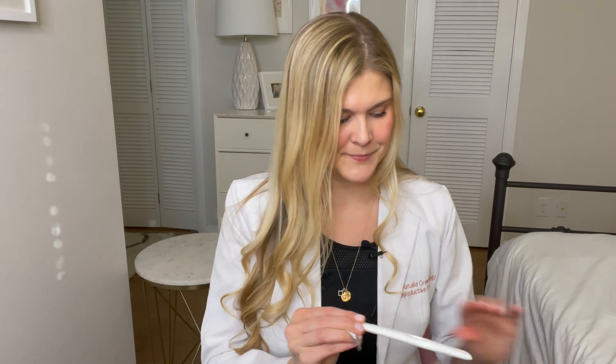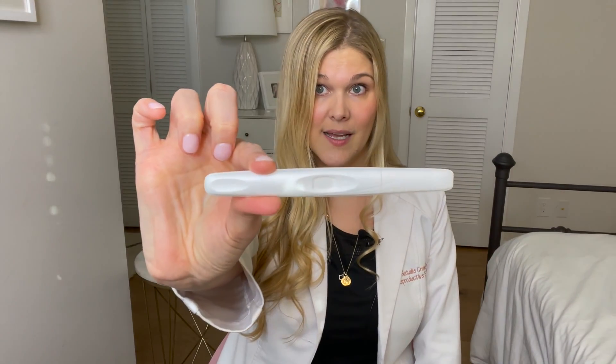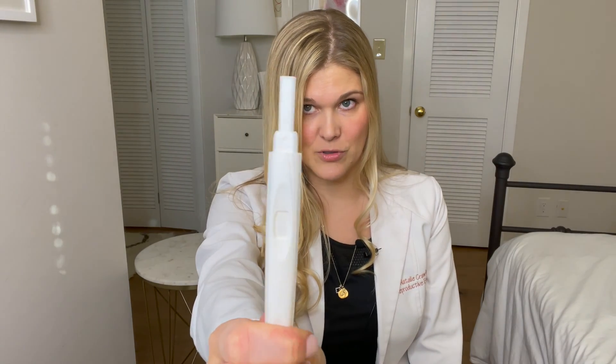Let me open it up. So this is what an ovulation predictor kit looks like — ta-da! That's it, guys. This is what you're getting. In this particular brand, you pull off the lid and you pee on this little part right here. That's the pee part.